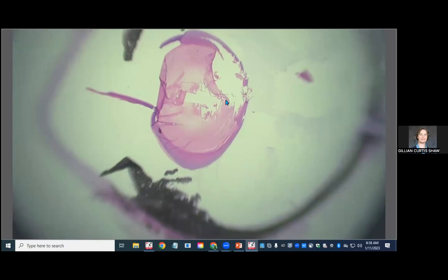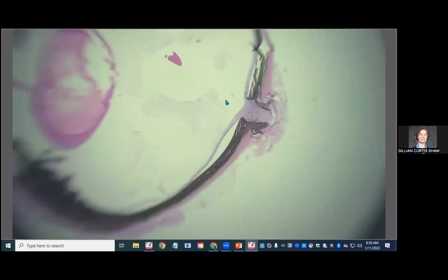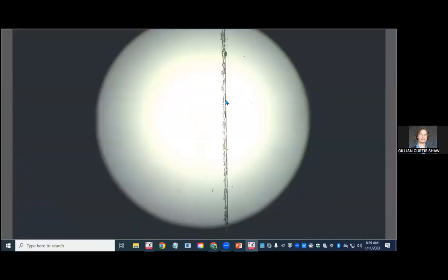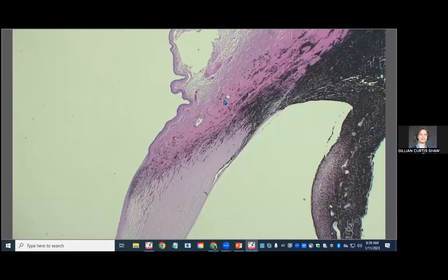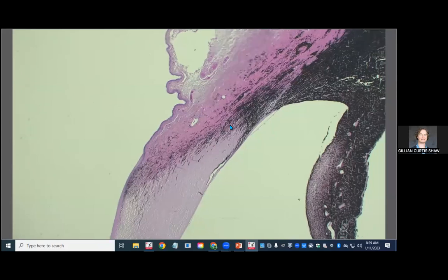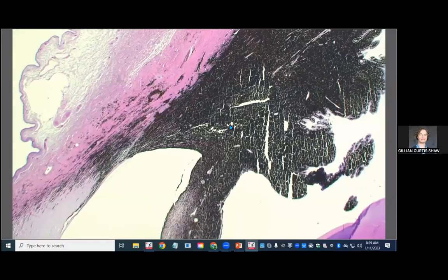The retina and optic nerve were somewhat unremarkable, even though there was a history of glaucoma. And I don't think we identified an area of previous corneal ulceration. So we'll start at the front. There's always some pigment at the limbus, but this has a little bit extra pigment, not surprising considering how extra pigmented the rest of the eye is.